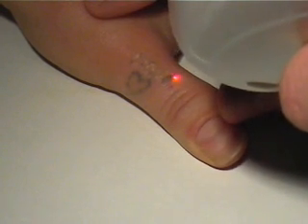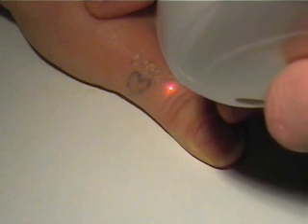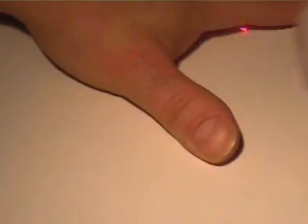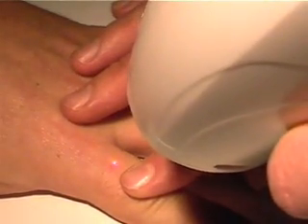With the laser set at 4 pulses per second, the remainder of the tattoo is quickly treated. The whole area takes less than 60 seconds to complete. A smaller area on the index finger is also treated to finish the treatment.